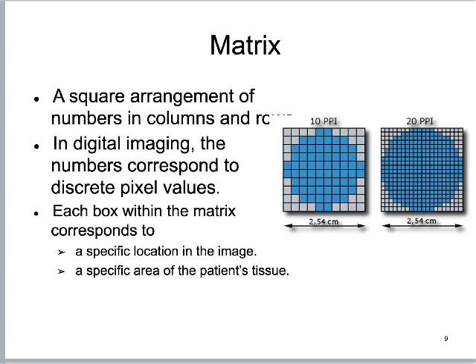So what I'm saying about matrices is this. They have a fixed size, right? As I start to try to apply them to larger and larger pieces of anatomy, that fixed size just gets stretched. So the pixels get larger and larger, and now I've got fishnet stockings, right? Now I'm back to that country of the little pixelated skeleton from Minecraft land, right? All the things get clunky looking again.